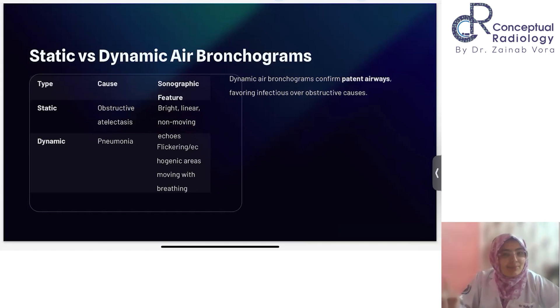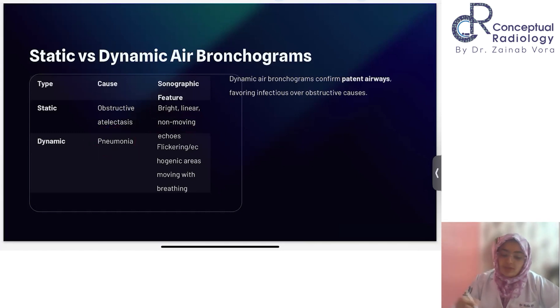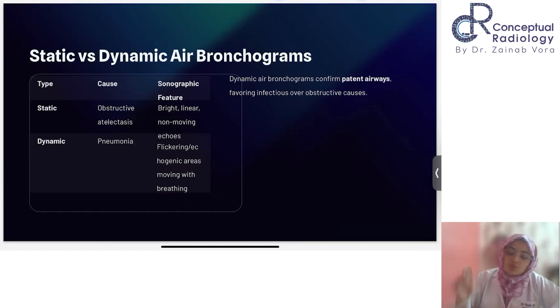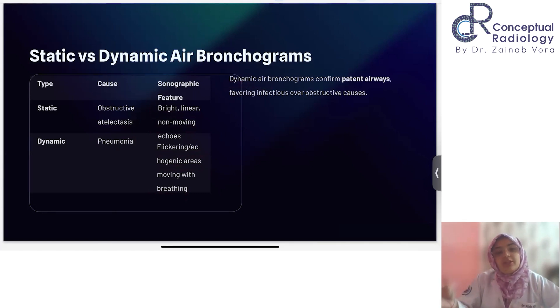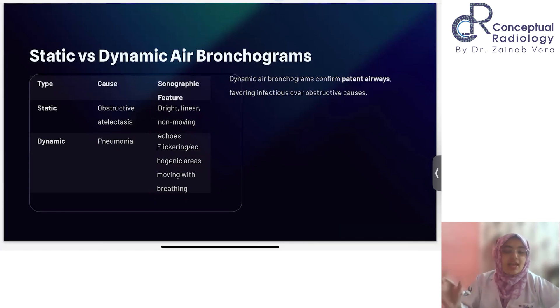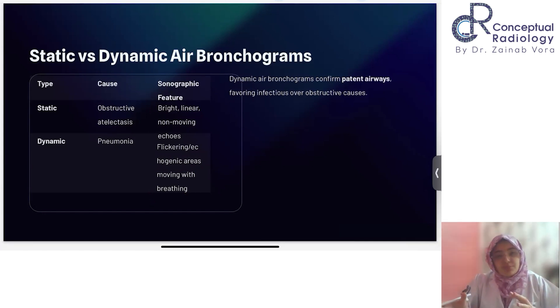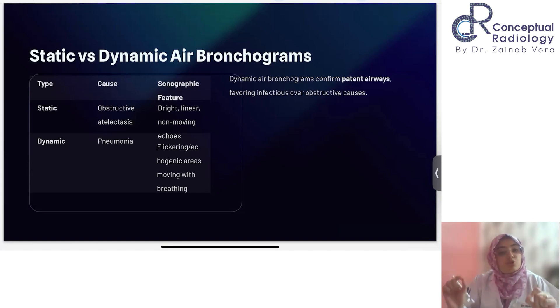On the other hand, a dynamic air bronchogram is seen in typical consolidation such as pneumonia, where you have flickering echogenic areas that move with every respiration — it's actually fun to watch. Dynamic air bronchograms confirm the patency of the airways. The background lung may have consolidation, a mass, pneumonia, or collapse, but the airways giving this air bronchogram sign are patent, meaning there is no obstruction.